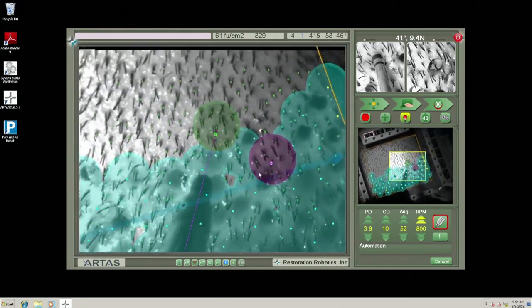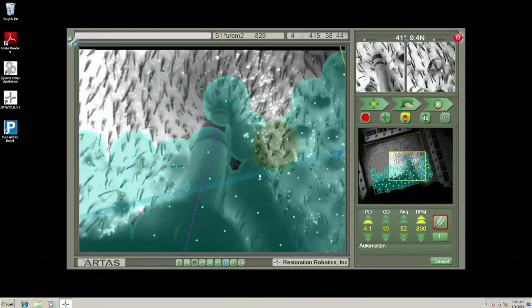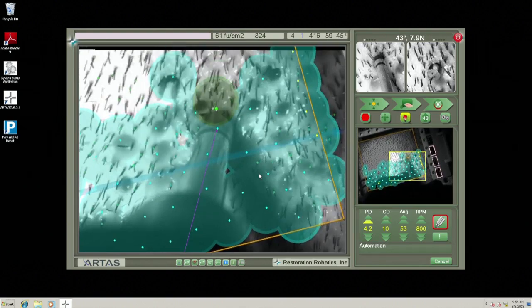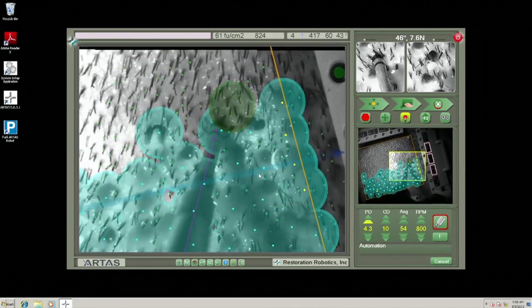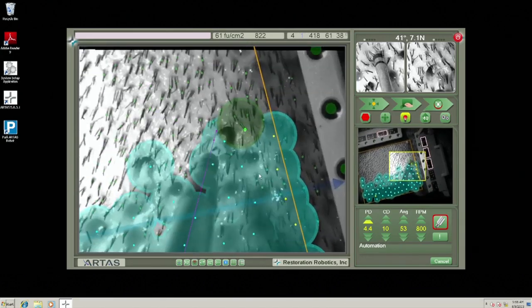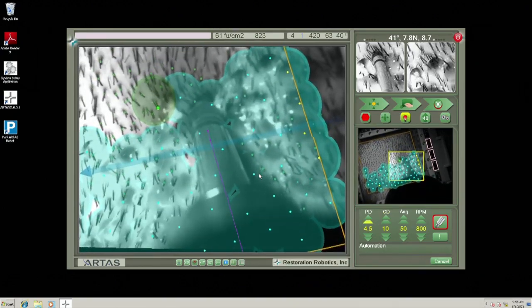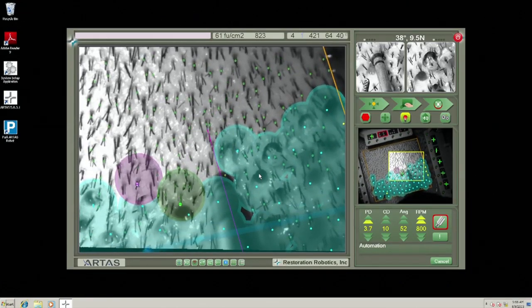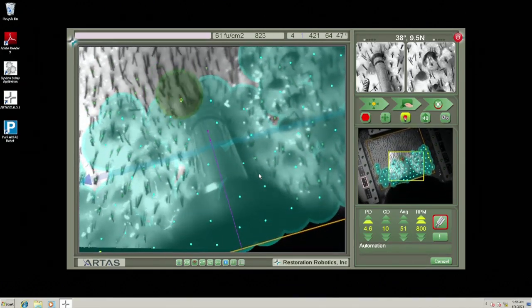Yes, this is Mike. Inside the robotic cart, there's an uninterruptible power supply. It's a rather large one, and if I were to walk in the room right now and unplug the system, basically the webinar would come to an end, but the system would continue doing what it's doing. It would just warn the operator that the power's been lost and that you should probably pause the system and shut it down in the meantime, but it wouldn't interrupt what the system is actually doing. All the pumps, the robotic arm and the software would remain powered up during that time, and you've got about 10 to 15 minutes once that happens.